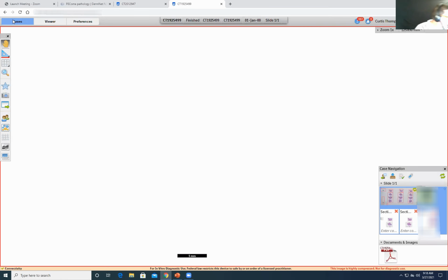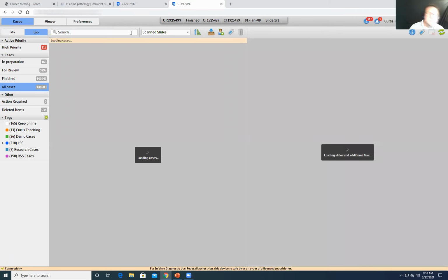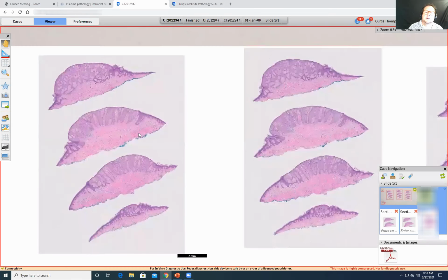This one is going to be number 12, which will be the next. We're almost to the last ones. Tee this one up, number 12, CT20. Here we go on this one.